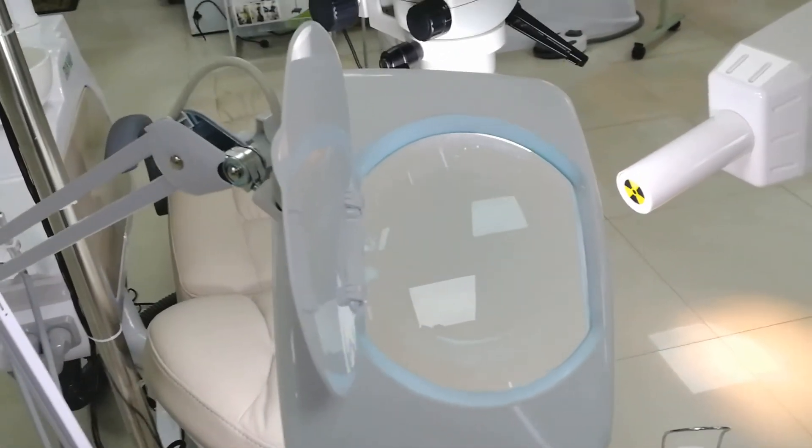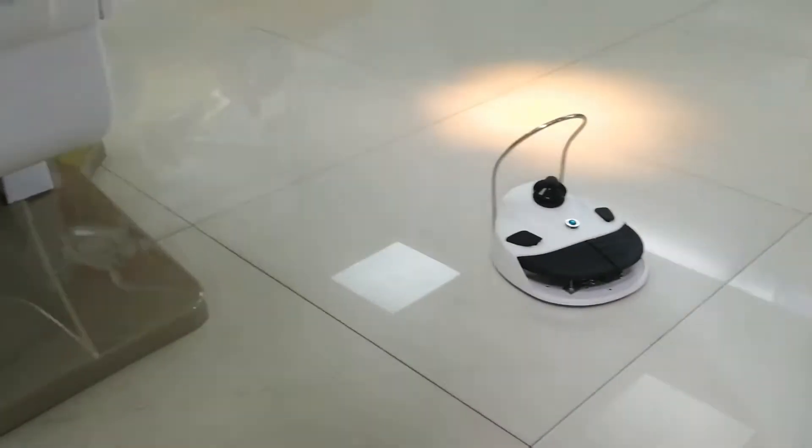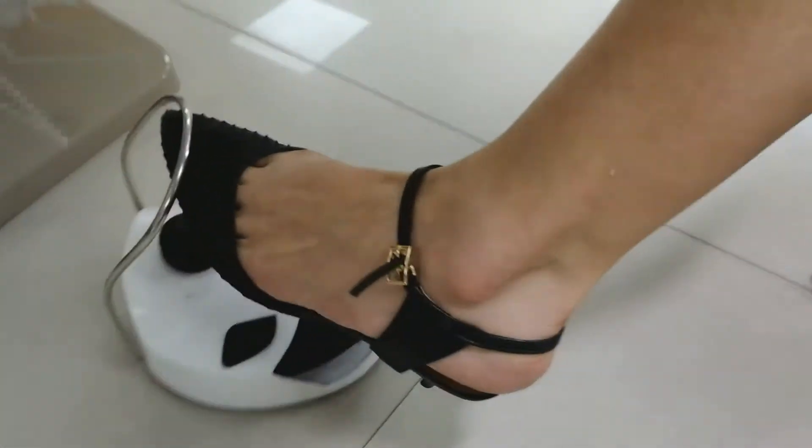This chair has a built-in WiFi foot pedal — very easy to use. Dentists can use it from different directions, right or left.